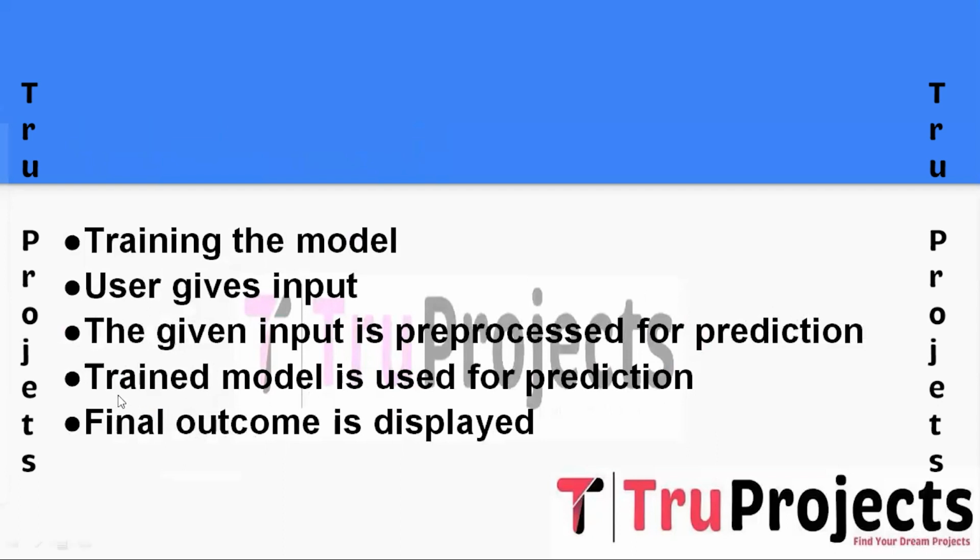And the eighth step is the trained model is used for the prediction. The pre-processed MRI images are passed through the fine-tuned ResNet 50 model for tumor classification. The model leverages the latent features to predict whether the tumor is present or not, providing a valuable diagnostic result to assist the medical professional in decision making.